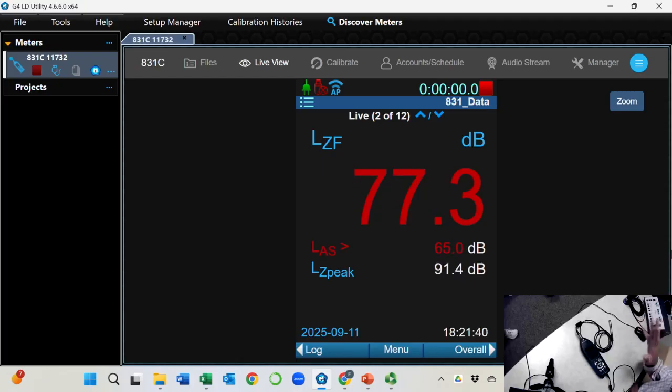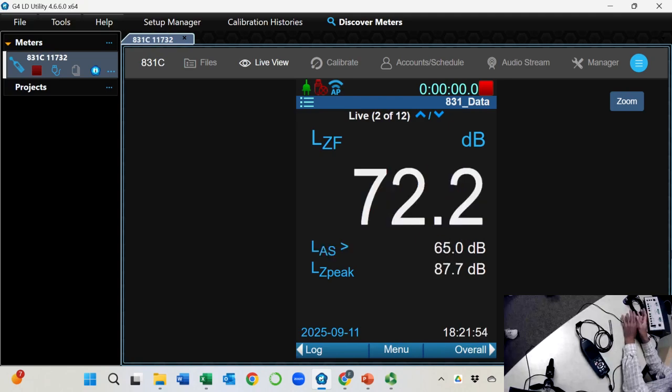However, the sound will always be 250 Hz at 114.0 dB SPL exact. Am I making sense? That's the reason it's a calibrator. The output is guaranteed. Does that make sense in terms of frequency and intensity?